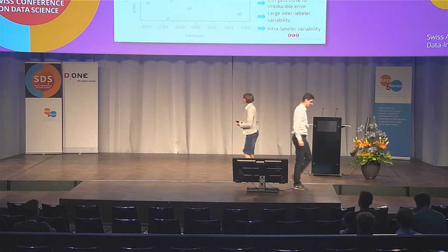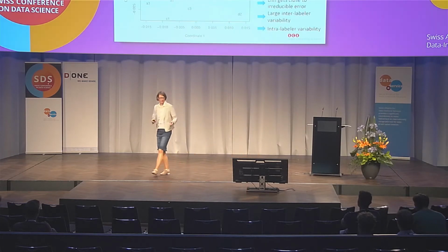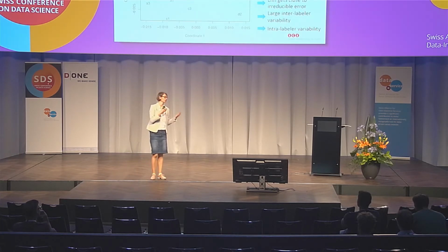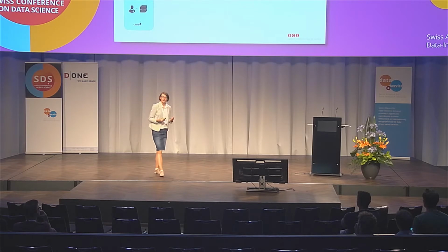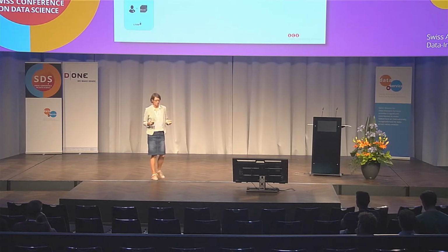So thank you, Pascal, for showing us the results of our study. I will now show you what machinery we had behind it in order to produce the data that generated these results. Now, what components did we use? First, for the prototype, we had 2 components. One was a web tool that we specifically developed so that these ophthalmologists could generate the lines, and we had labels available for our training.